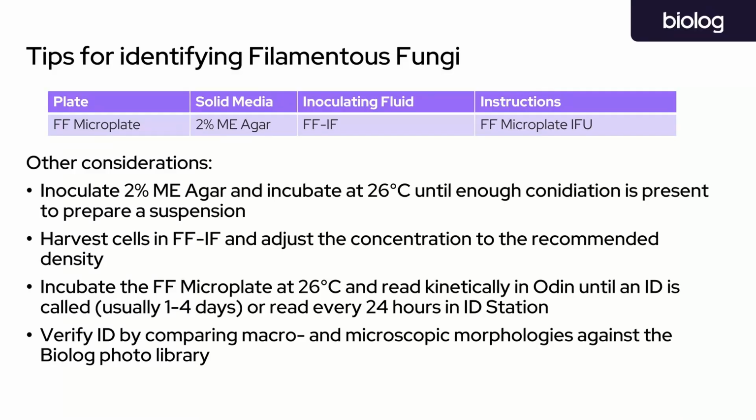And the additional feature that we have for filamentous fungal identification is that sometimes it's very difficult for the ID algorithm to get to that 0.5 threshold for the similarity index that Dina was talking about previously. It is necessary then to confirm the identity of your top match using morphology.